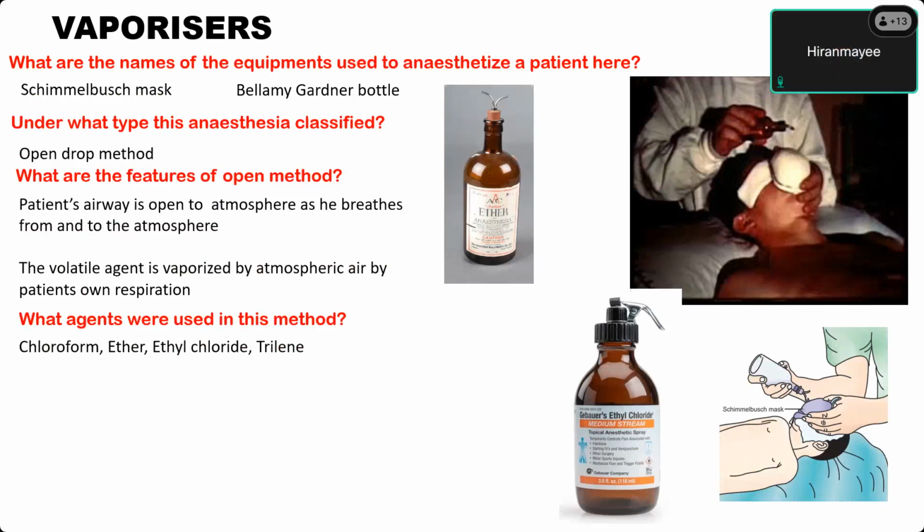2 atmospheric pressure. So once you press this lever, what will happen to the gas? I mean the liquid, will it come out as a liquid or as a spray, vapor spray? Vapor spray, sir. It will come out as a vapor spray. Okay, that is why this lever and this small delivery nozzle are kept here. The gas is under high pressure, and this is an amber colored bottle because it is also photosensitive.